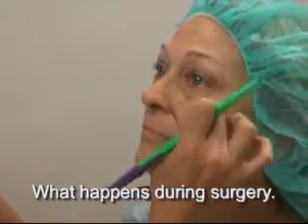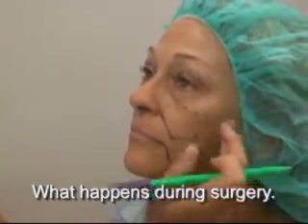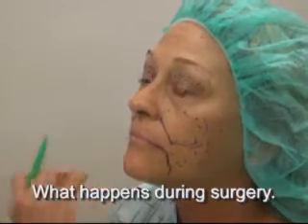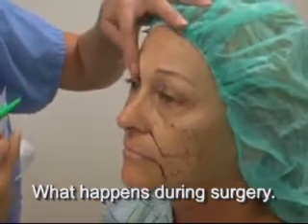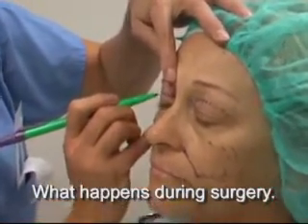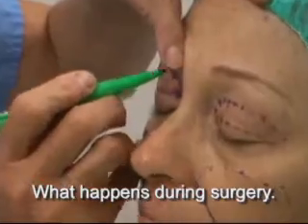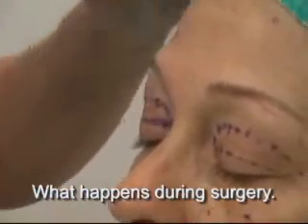And so those are the areas we're going to give more pronounced fat injection to, softening and feathering around the lateral contour of this, doing the excision of the extra eyelid skin. Close your eyes for a second. Using the incision at the superior part of the crease here, removing this section of skin above it, as well as some of the fatty tissue immediately.